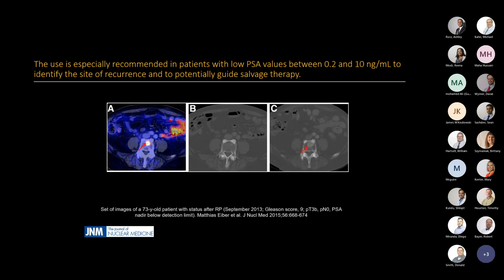One thing we also discussed in our clinical practice: if you have a focus of increased uptake in the bone, but the correlative CT scan is negative, they say you should probably still trust the PSMA imaging, because you may not see any change on the CT scan in early cancer, but eventually you may see sclerosis. We do see this in breast cancer a lot. Sometimes we see FDG activity in the bones, but there is no corresponding CT abnormality. However, in follow-up imaging, we start seeing treatment-related sclerosis. So whenever we use F18 FDG for breast cancer, no matter the CT correlate, we usually call it. It is similar to PSMA imaging.